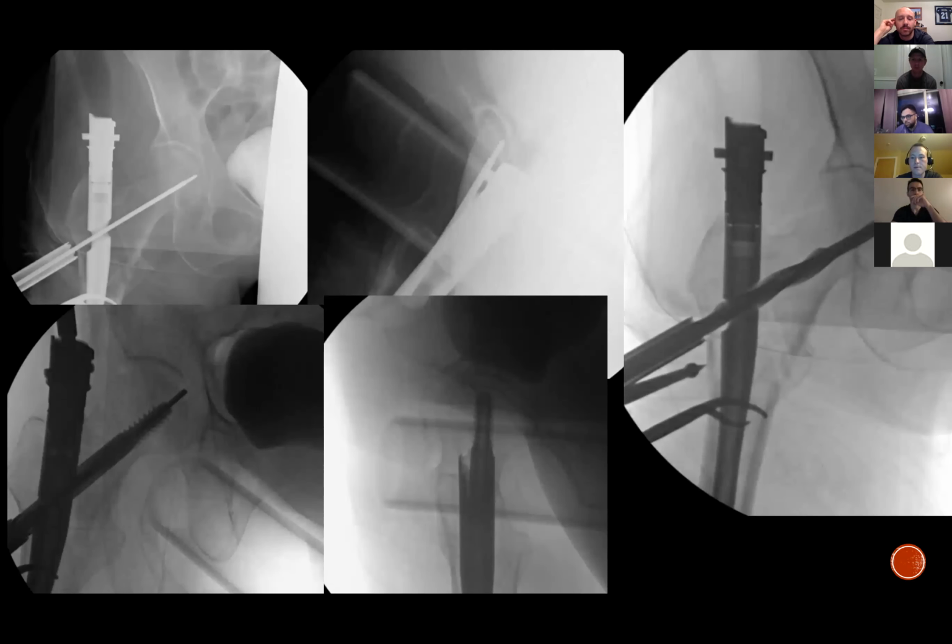Maybe it's easier to start with the nail. In a nail, as this proximal segment begins to shorten along the length of the crosslock bolt, one of two things is going to happen.